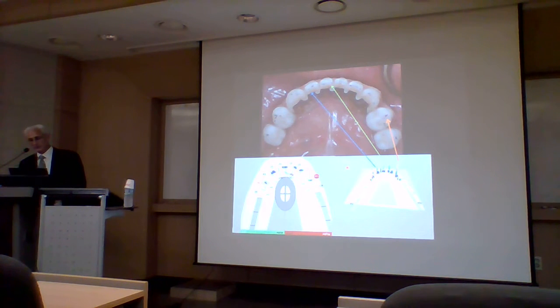An example of how someone might choose incorrectly is this contact on the 3-4, which over here you can see is very low force, right, even though it's a large mark. And here you have the smaller mark on the 4-4, and you can see it's much higher force. 교합시켰을 때 34, 44가 비슷하게 찍히지만 스캔을 보니까 44가 의미 있게 높다라고 하는 걸 알 수가 있는 거고, 교합지만 가지고는 알 수가 없는 거죠.